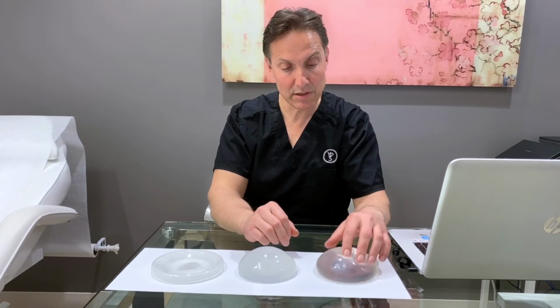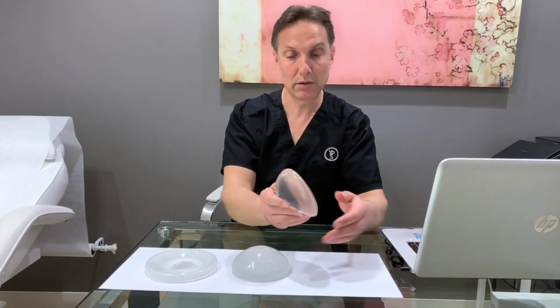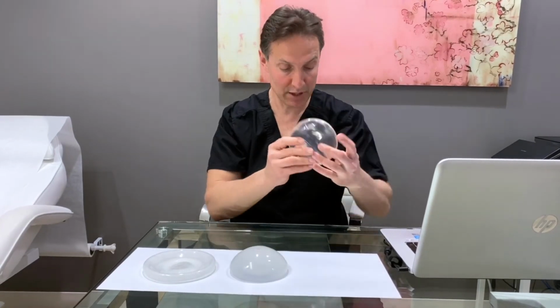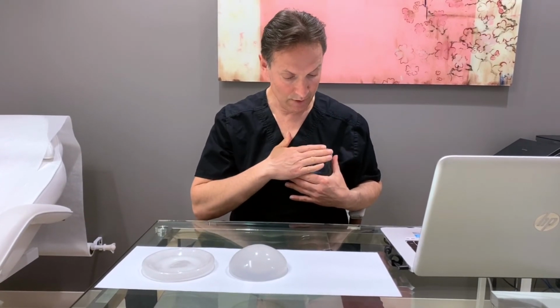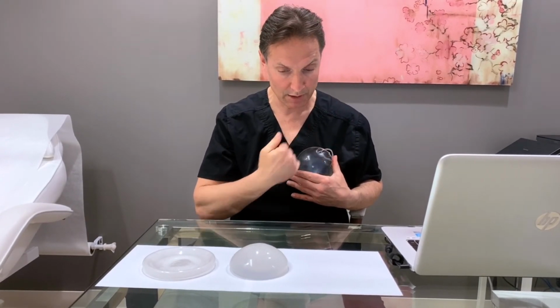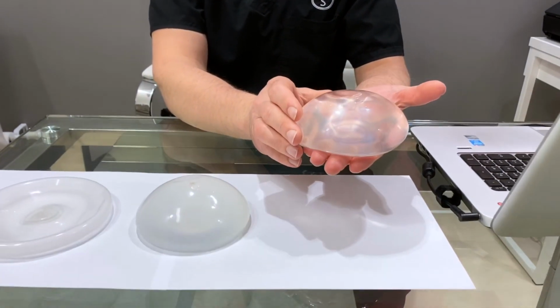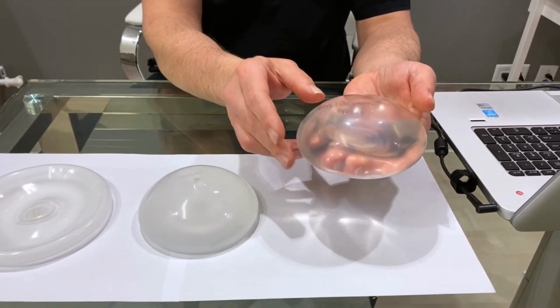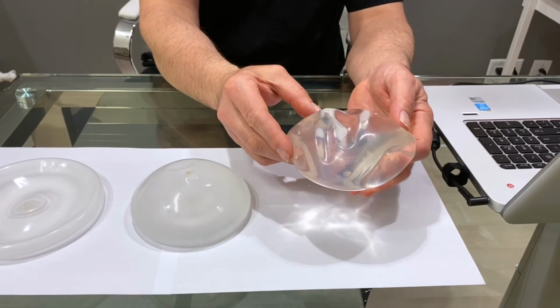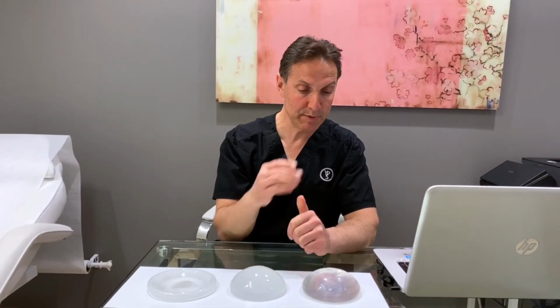And then on to a silicone implant. Silicone implants have some unique advantages and disadvantages. I think one of the advantages is they tend to hold their shape a little bit better, so that might give you more upper breast fullness. If the implant is sitting in your body, it might help retain the fullness up top that people are wanting in the cleavage. They are very durable. They have about a 1% risk of breaking every year. It is important to realize that's a cumulative risk, though, so over many years, that risk slowly goes up. So advantages are holding their shape better and possibly giving you more upper fullness.